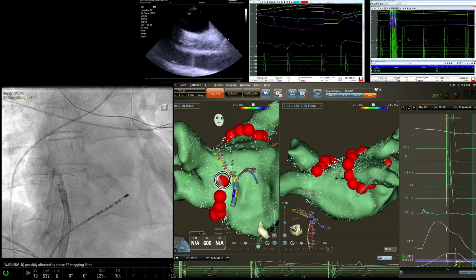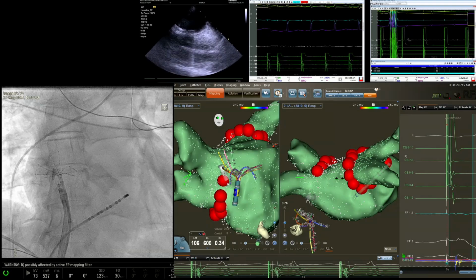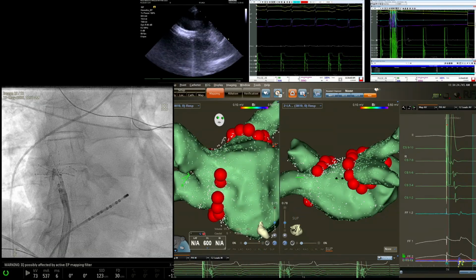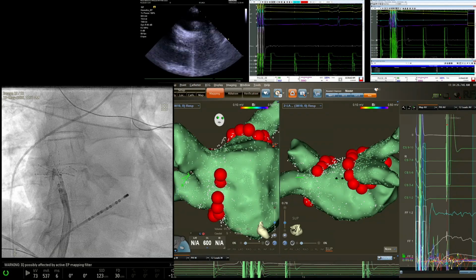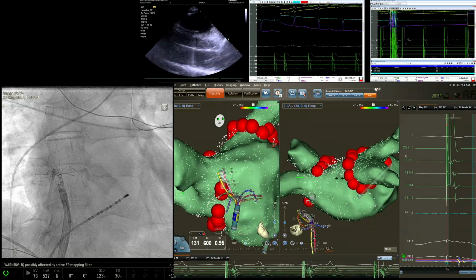So Vivek, it's Paul Gould. Hey, Paul. How you doing? Good. What parameters do you go for the force? Well, so right now the force is actually a numberless thing. It's not actually calibrated yet. Okay, so all I know is I have binary.